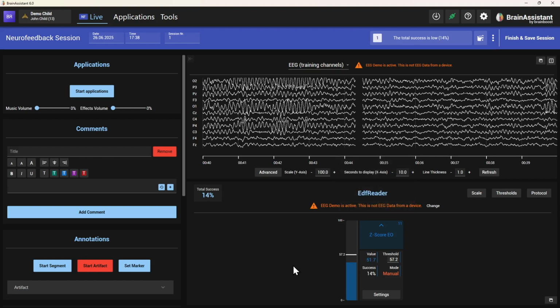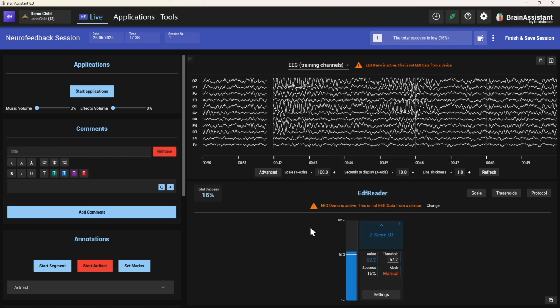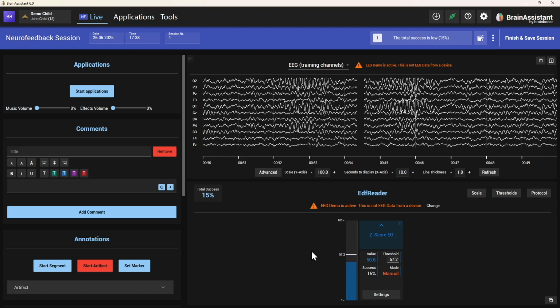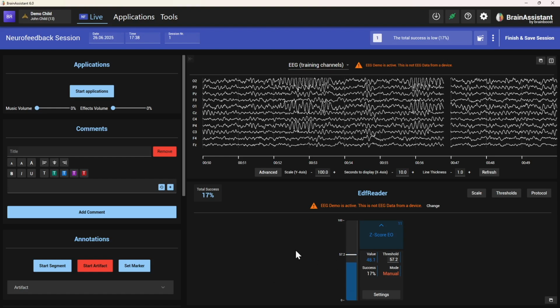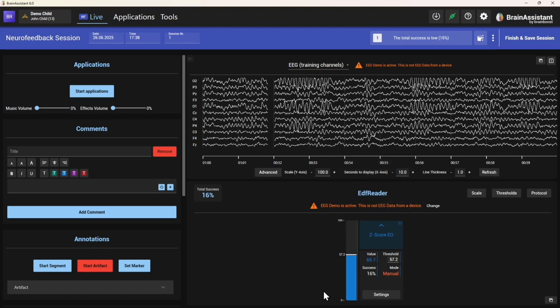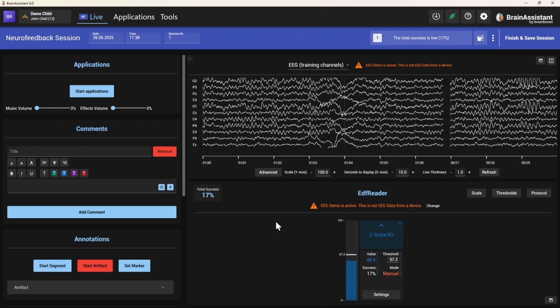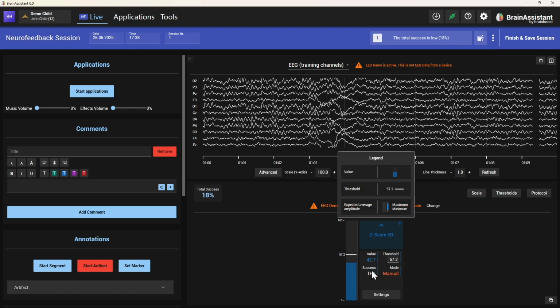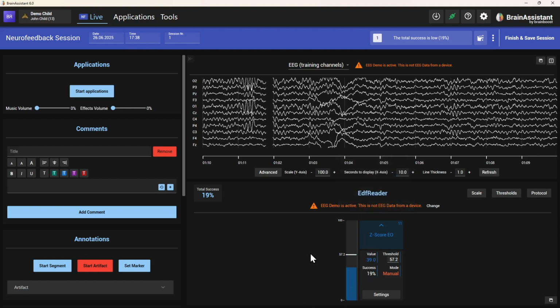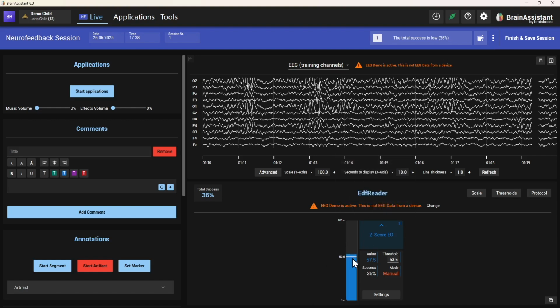And this is what I meant with the weight I can give to values approaching the 0.5. This is where the smoothing comes in, because if I just take theta without any smoothing, I'm either jumping from 0 to 100 or from 100 to 0, back and forth. I'm inside, I'm outside. This is why you need a number of positions and frequency ranges, and with the smoothing, this gets smoothened, so it's not moving up or down too fast, and then the feedback is not a pitch black screen or bright screen, back and forth.